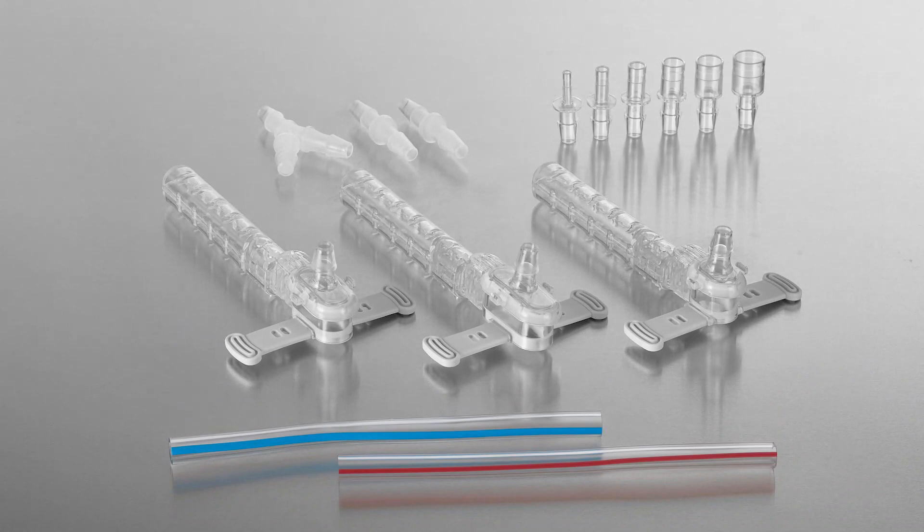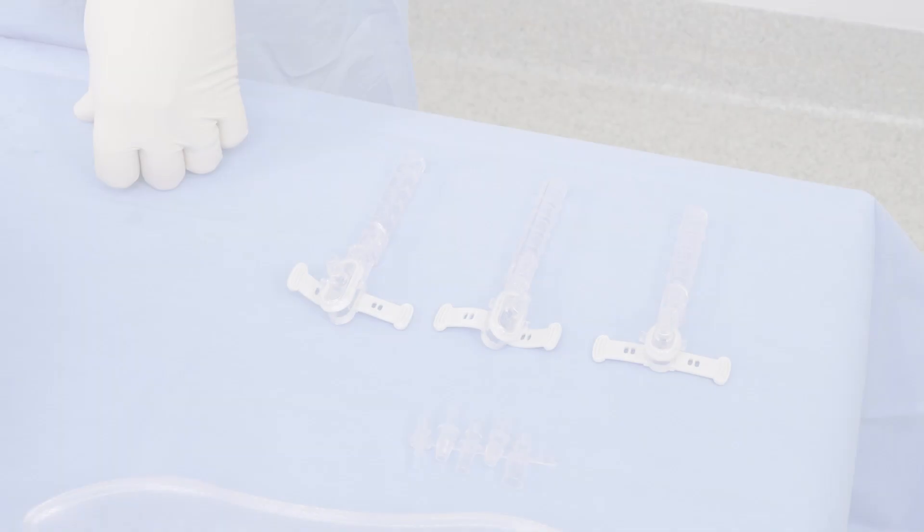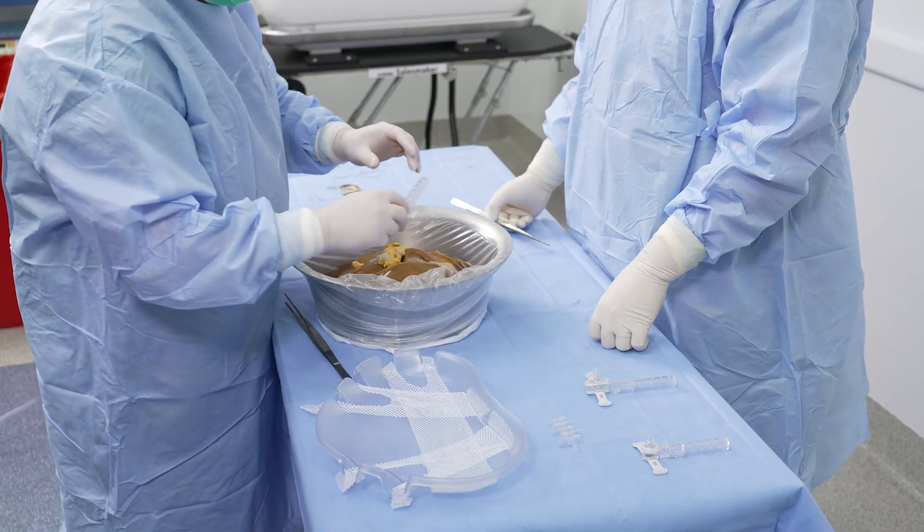If the hepatic artery ends in an aortic patch, use the seal ring cannula for cannulation. Select the cannula that is closest in size to the aortic patch. Using standard aseptic technique, introduce the seal ring cannula onto the sterile field.